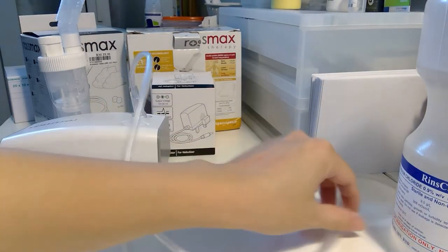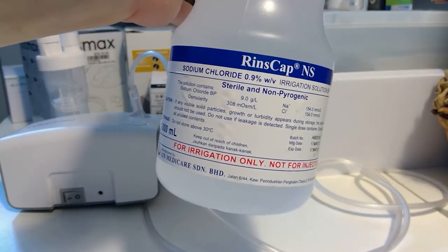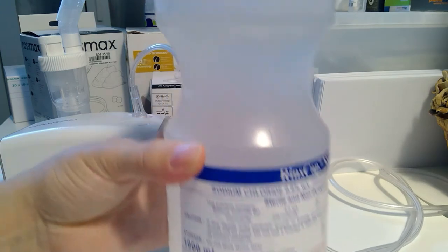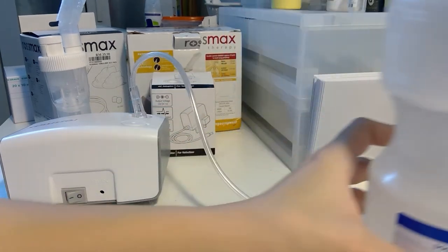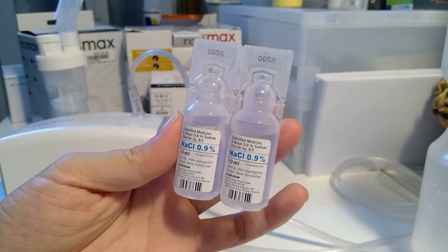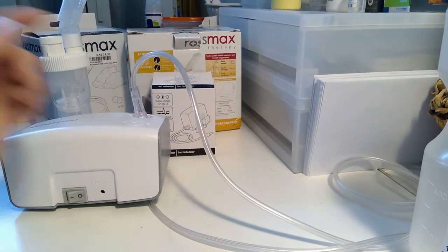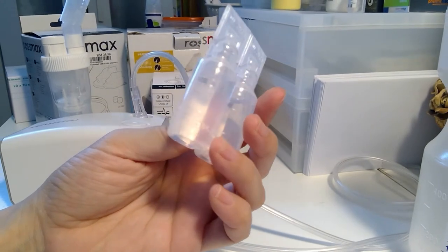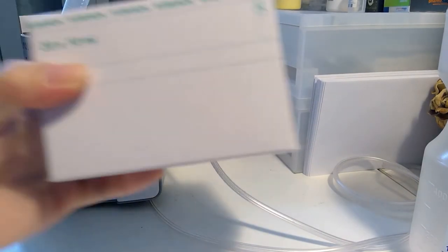The next thing is the saline solution. This is commonly seen in the pharmacy — sodium chloride 0.9%. Some people say you can get a big one-litre bottle and it'll last quite a long time. But the vet told me it's really about how hygienic you can keep the item. I'd recommend something like a vial. There are smaller vials around 3ml, but this is the one you can easily get from the pharmacy. Keep it to the maximum level, and if you're using the larger bottle, discard the remaining solution after 24 hours. You can buy a single pack like this from the pharmacy or online.